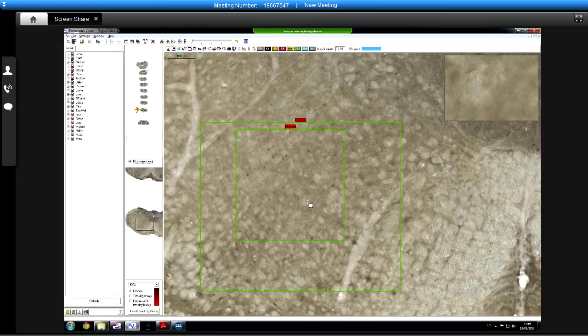Had you deleted the box? Okay, if you just click on, because even if you don't save, it stays there. Yeah, if you click on Manage Annotations up the top here, and then just select one, so say we want to get rid of that caption one, then you can just delete it.